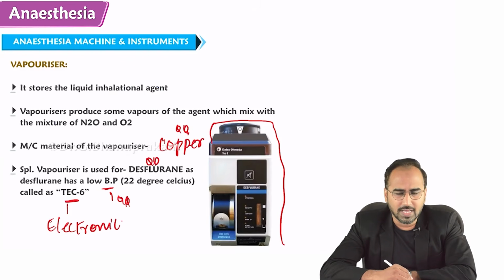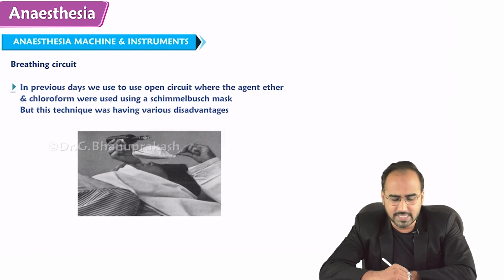Now, all the gases from the vaporizers are delivered to the patient with the help of a breathing circuit.